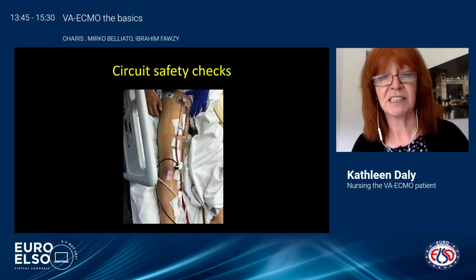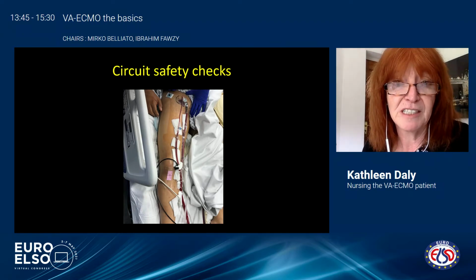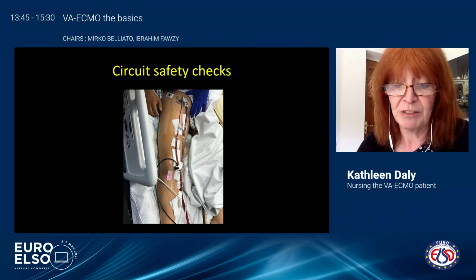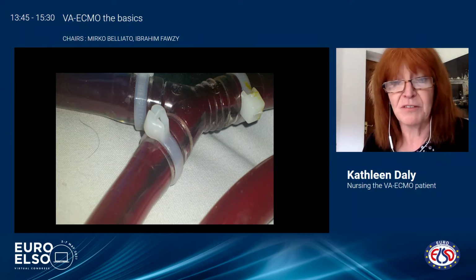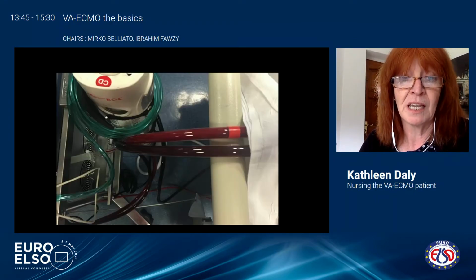If we think about it, at the beginning of each shift, the ECMO nurse needs to do a tip-to-tip assessment, access cannula through the membrane to return cannula of the ECMO circuit. We need to be looking for any clots, particularly around areas of turbulence, any fibrin stranding, and that we have gun ties in place.